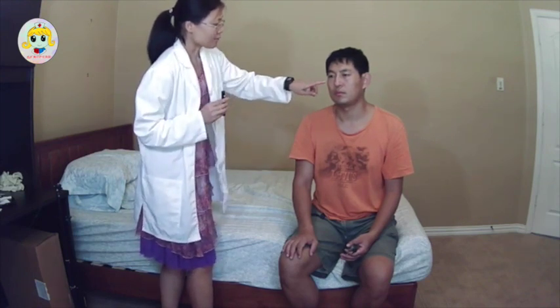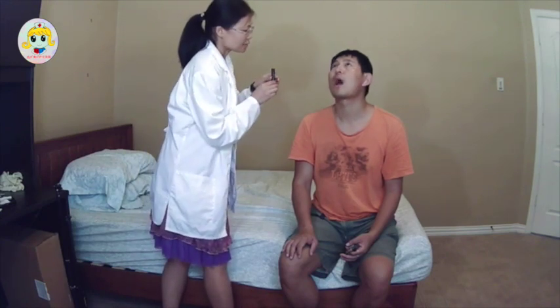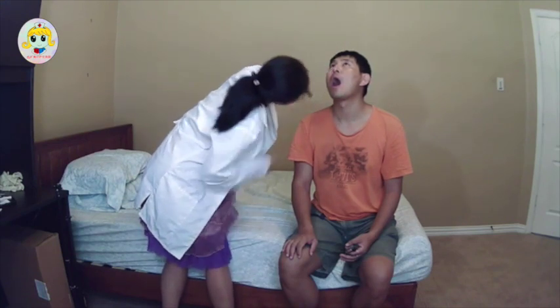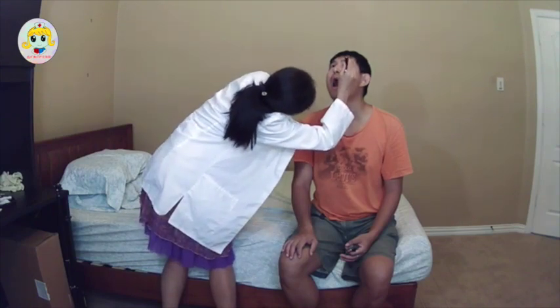And then I will do the transillumination test. I will use a light to shine below your maxillary sinus, and then observe it through your mouth. Okay. Now please look up for me, please, and open your mouth. Okay. I see the light through the upper palate. Then the other side. Yes, the same. You can close your mouth. I see lights on both sides. That means the maxillary sinus is clear. There is no occlusion.